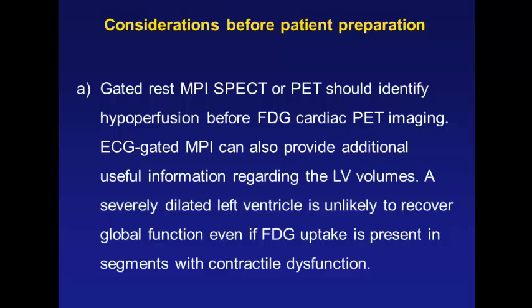I would like to see a non- or underperfused segment, so we need a perfusion test indicating this. Second, I would like to know that that specific segment, exactly the one which is underperfused, is not contracting well or is not contracting at all. So we would like to have some gated test which is linked to the perfusion. That is, I think, a very important part of it.